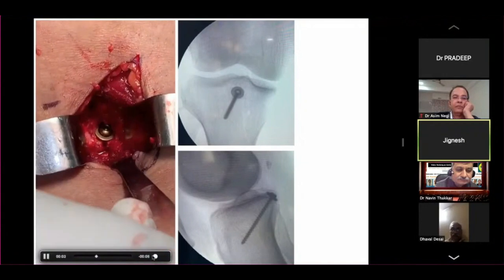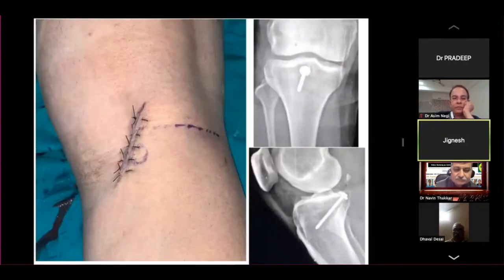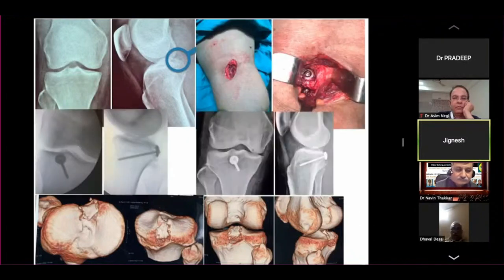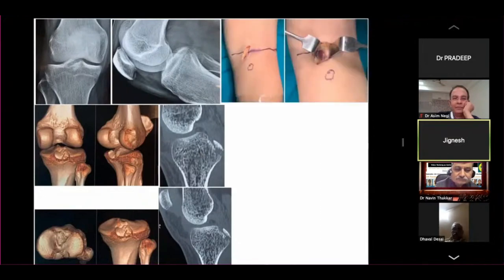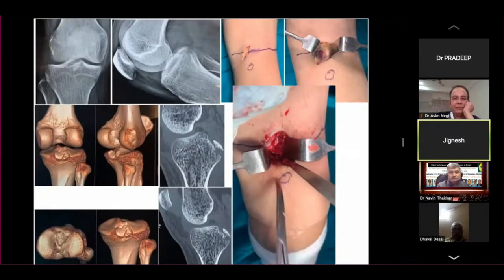The screw is fixed and you can see the IITV images. This is the closure — a little bit larger incision just to have a better idea. Another similar fragment and similar incision — another piece of PCL fragment. These two small incisions are there and you can see the fragment in front of your eyes. You can see the whole crater, put a spike distal to the crater, reduce under vision, provisional K-wire, and put a screw.